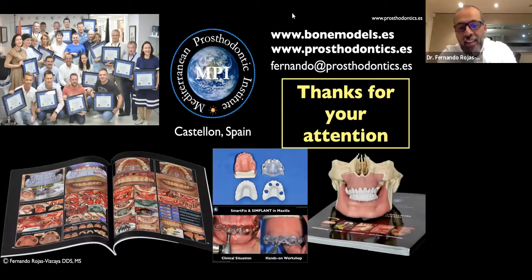In some cases, I started doing this VIP protocol, but the oldest case is, I think, 2.5 years. The main problem is the fitting. This is for sure working very well because you control every aspect. And what I make in the verification device, you can do intraorally also, but in specific cases. I told you at the beginning that it has some limitations. This is for edentulous patients where you don't need to open a flap, you don't need to reduce bone, because in that patient, once I make the immediate loading, the next day I can call the patient, remove the prosthesis, and make the same process, but in the mouth.